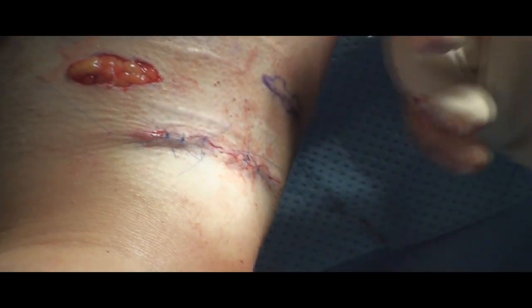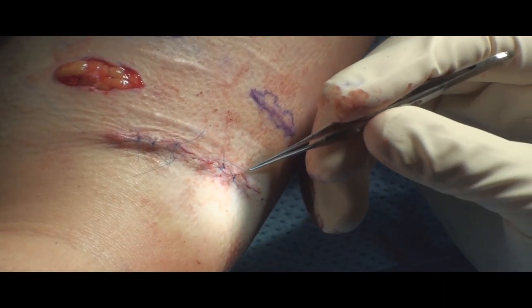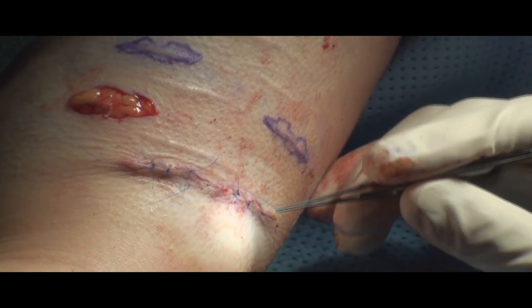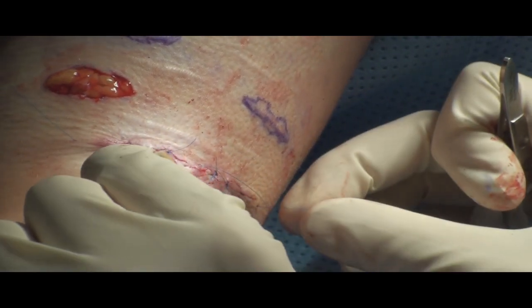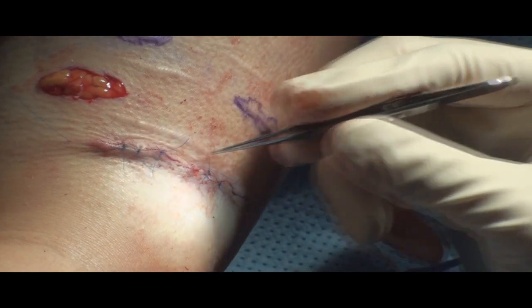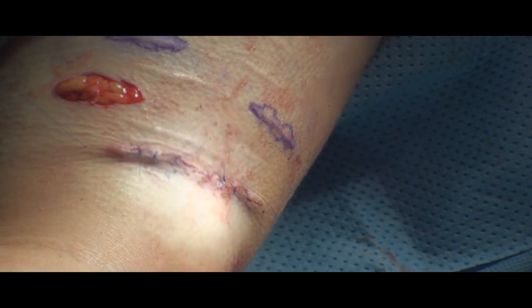And this shows the result of that closure. One interesting point I wanted to demonstrate here is that most of the sutures that I've done here are underneath the area that we took out. We avoided a lot of the superficial closure by doing the closure underneath here. And these are the sutures that are coming from this area that we improved. This suture goes in and out underneath so that we avoid making any marks and sutures on the outside. So that improves the ultimate result of the scar revision.